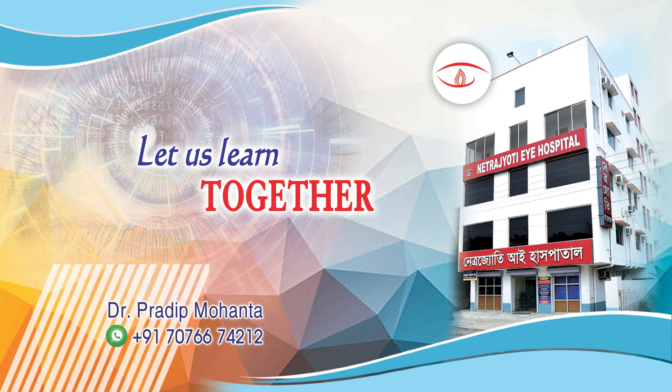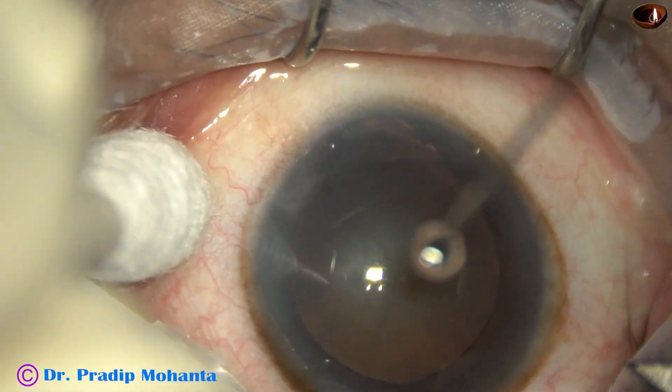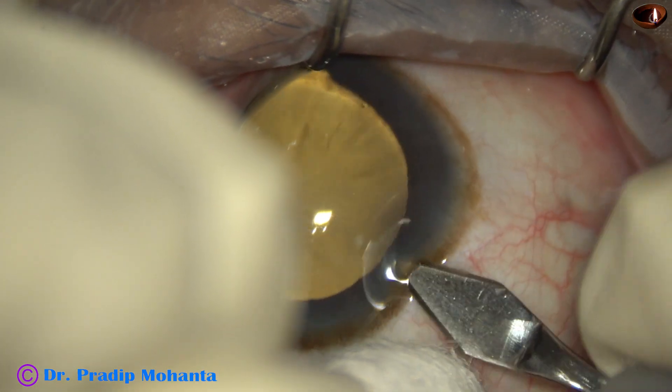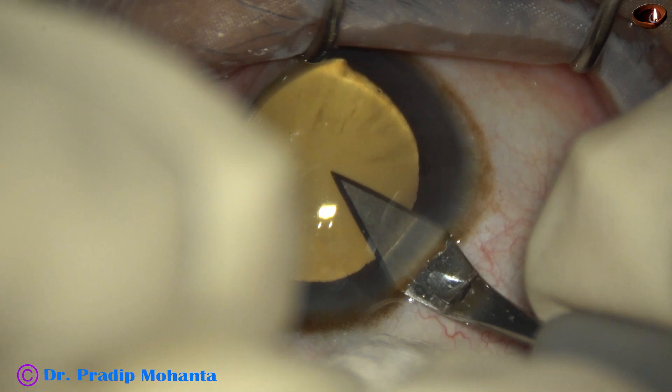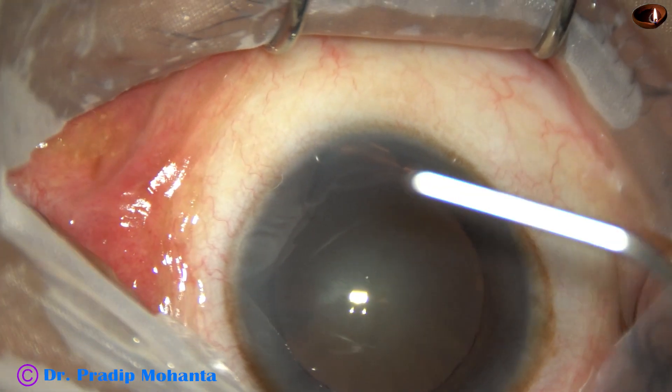Welcome to my workplace at Ranaghat, West Bengal, India. This is a cataract with coloboma iris and weak zonules. The cataract is soft; nuclear sclerosis is grade one plus or grade two. Let us observe this surgery.